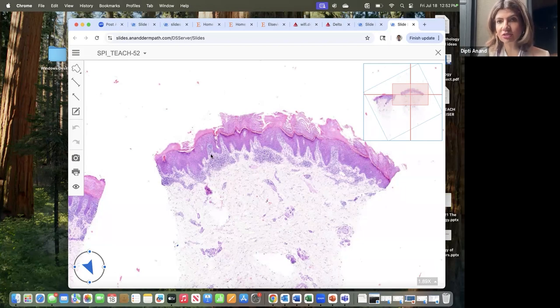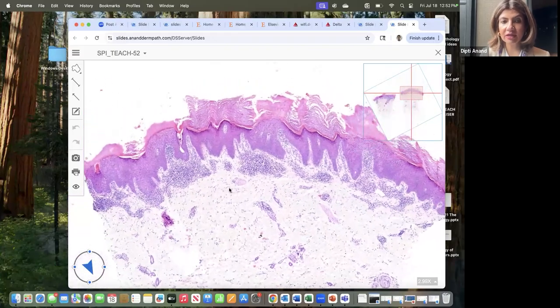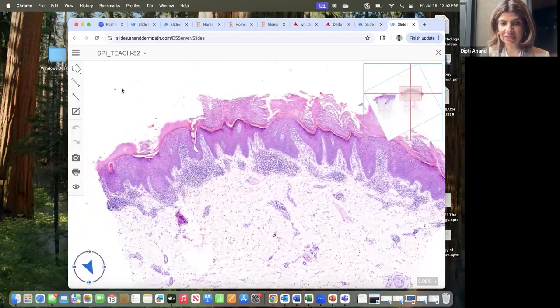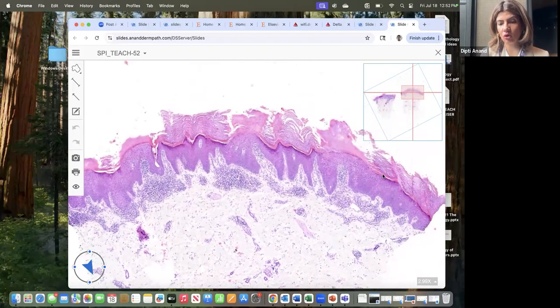So inflammatory linear verrucous epidermal nevus is a psoriasiform kind of epidermal nevus. On biopsy, the background epidermis is thick in a psoriasiform pattern, as what you see in here. The bulbous rete ridges and suprapapillary thinning, you see that. But what you see is a very distinct pattern of cornification, and that's what makes the diagnosis. So what you see in here is alternating parakeratosis, orthohyperkeratosis, parakeratosis, orthohyperkeratosis, so you can see the nice alternating broad columns of orthohyperkeratosis and parakeratosis.